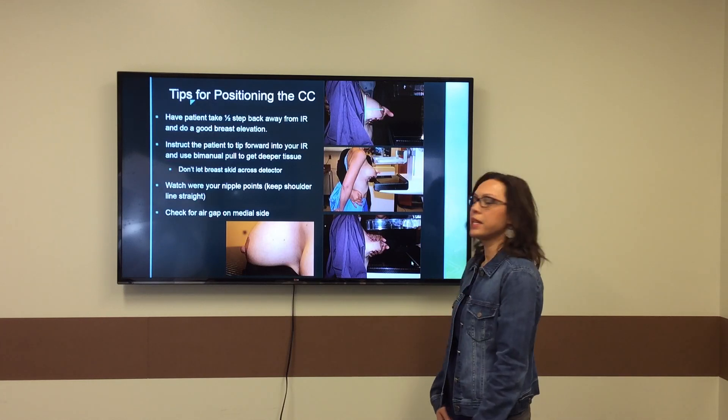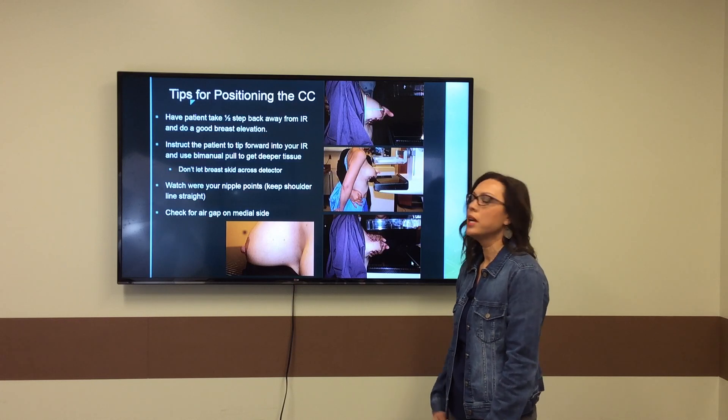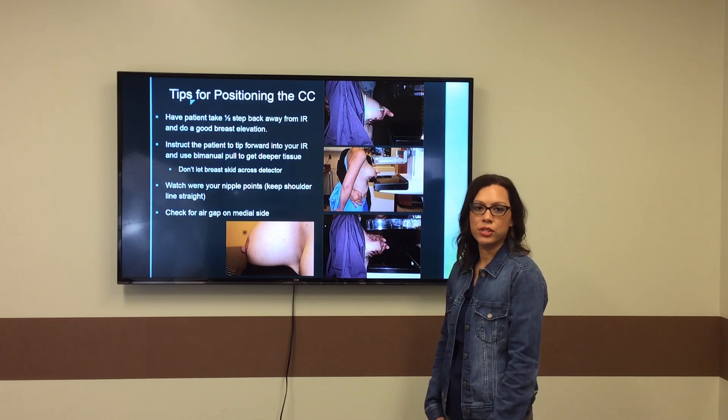Of course, you'd be standing on the medial side, you'd ask your patient to look at you, and bring her head around to the side of the face shield.